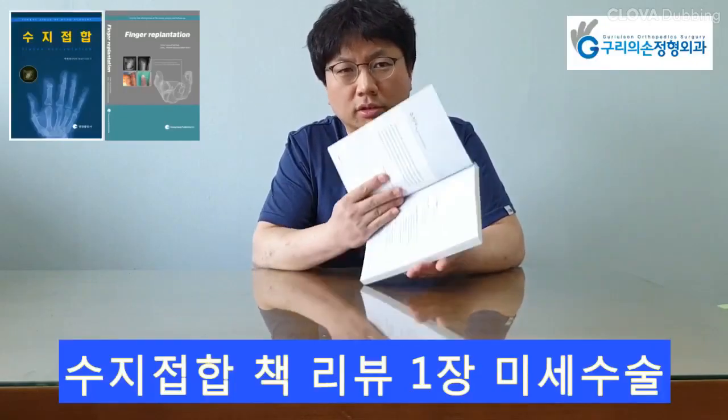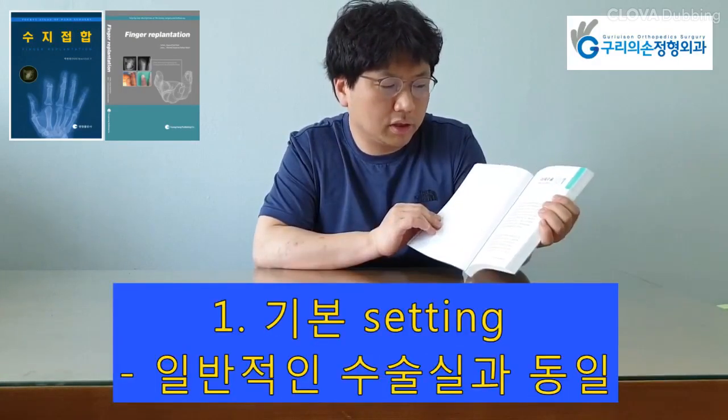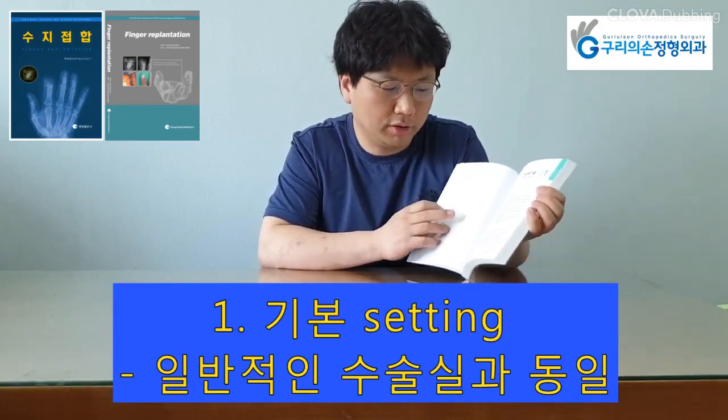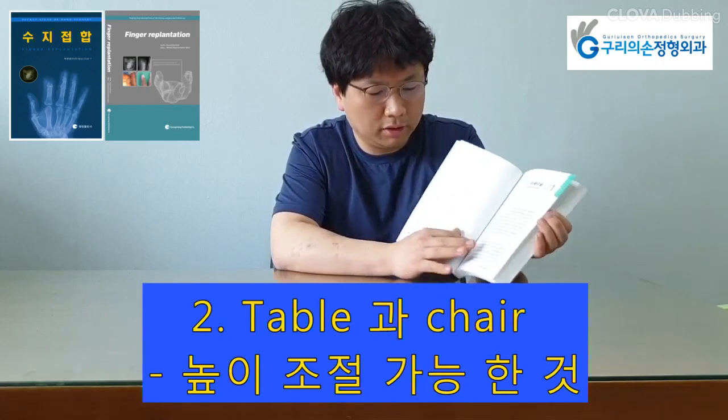Finger Replantation, Chapter 1: Introduction to Microsurgery Instruments. Surgical instruments required for finger replantation are the same as the instruments commonly used in a microsurgery operation theater.